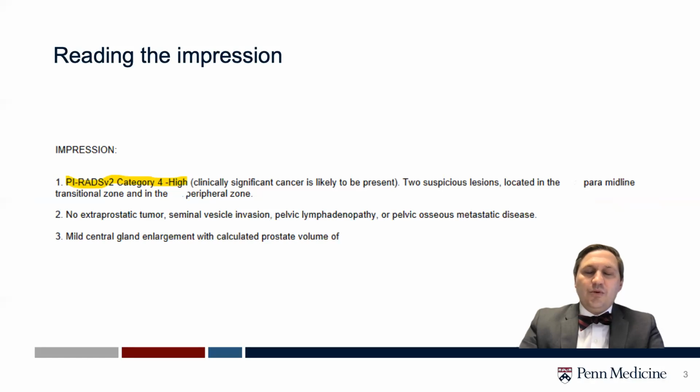When you get your report, you will likely be able to access it through the electronic medical record, and you will see that generally on top they will have the impression. The impression is the area that you're most interested in. There is probably lots of technical information between what you're looking for and the impression, and so I would likely just ignore most of that because that's mostly for other radiologists.